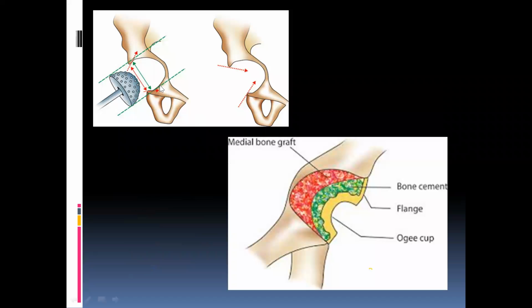So you can see in the picture above, this is the sequential reaming when you have got the reamer only at the periphery, when the cup is convergent, and sequential reaming when you reach, for example, 48, it will not reach the tip of the medial wall in order to maintain this divergent side of the acetabulum.